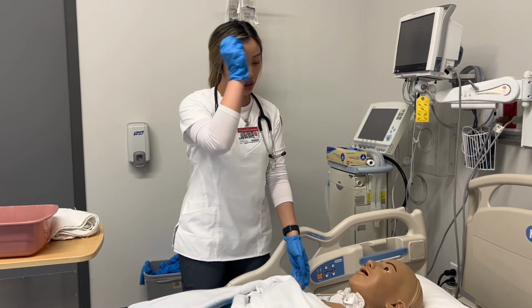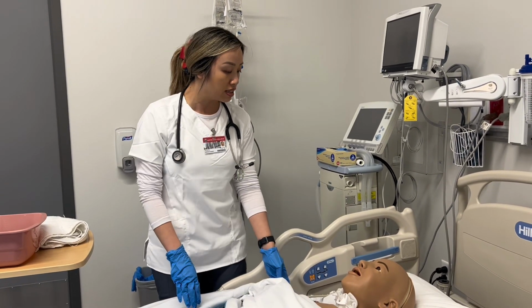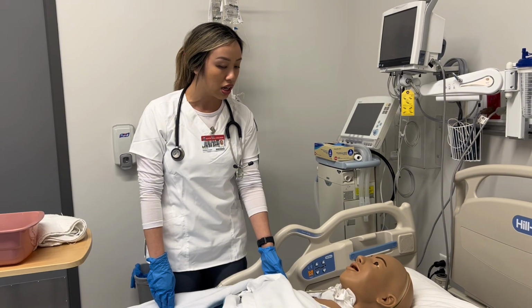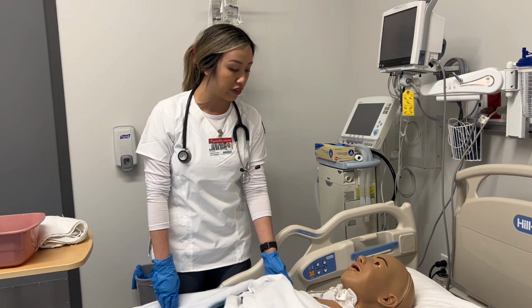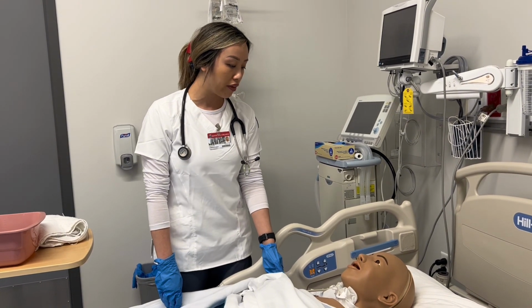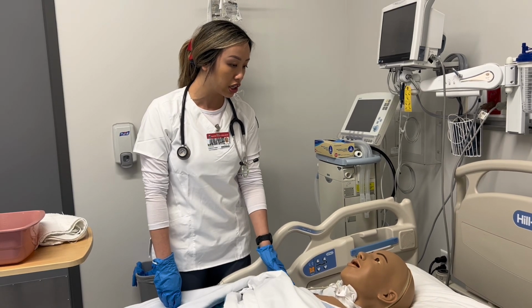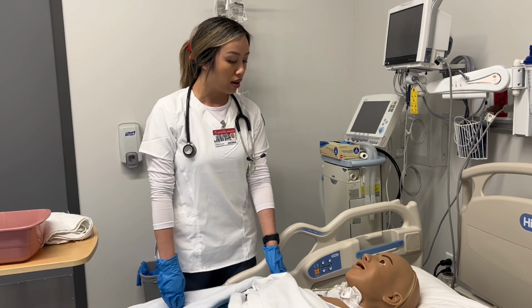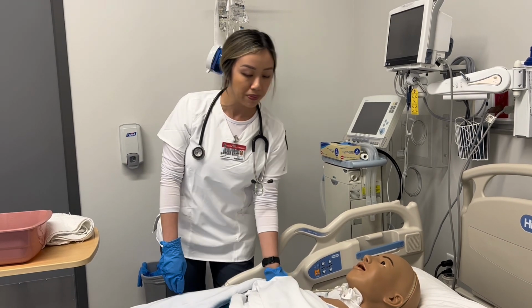I checked your chart. It doesn't seem like you're eating very well and you're having difficulty getting your meds. So the doctor wants to place this so it's easier for you, okay? It's going to be a fairly quick procedure. It shouldn't hurt. It is a little bit uncomfortable, but we've done this plenty of times, so we'll make it as fast as possible, okay?